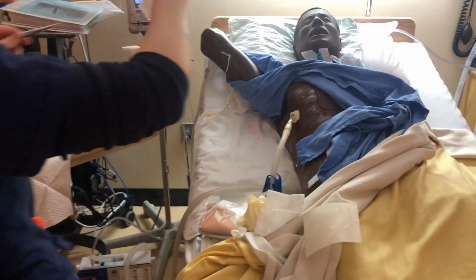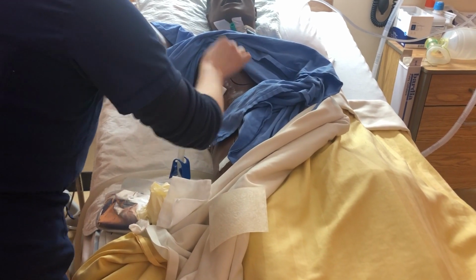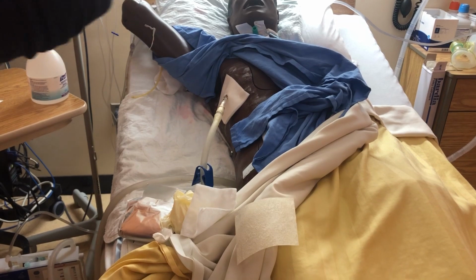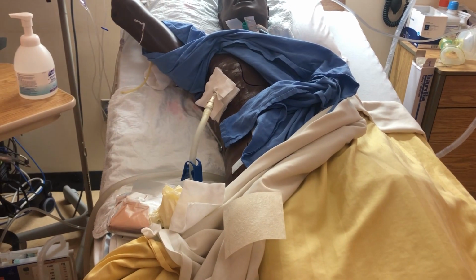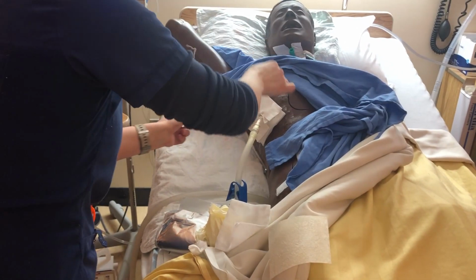Okay, so now I'm going to just put on my drain sponges. So we'll put one on one way, put another on in a different direction, then a gauze, one 4x4 over top.